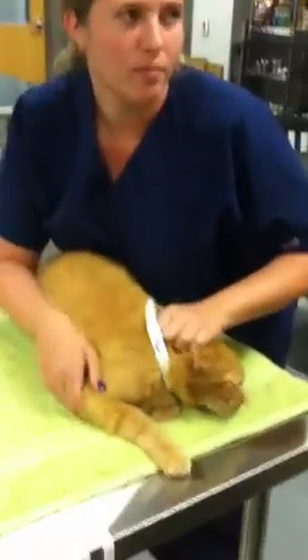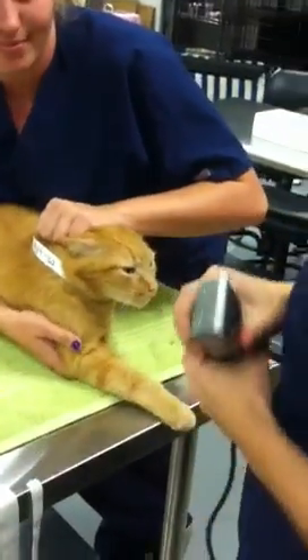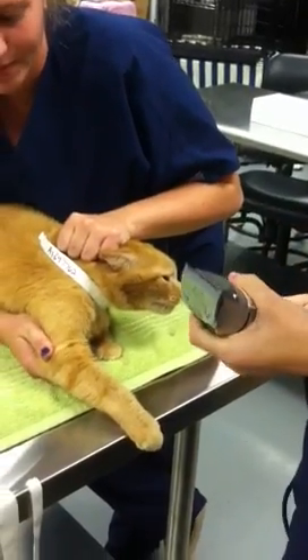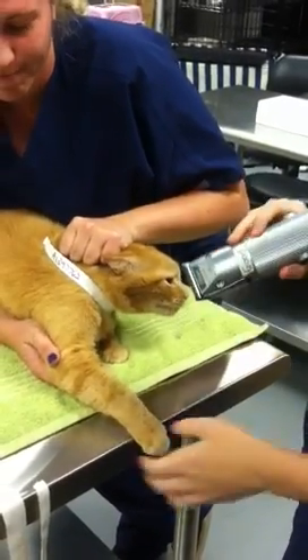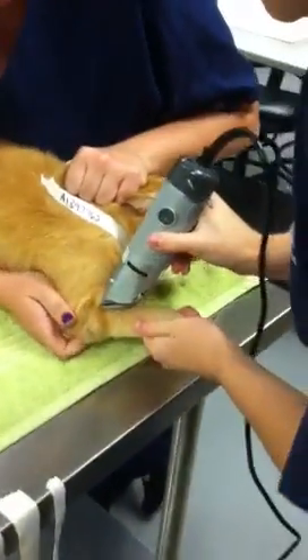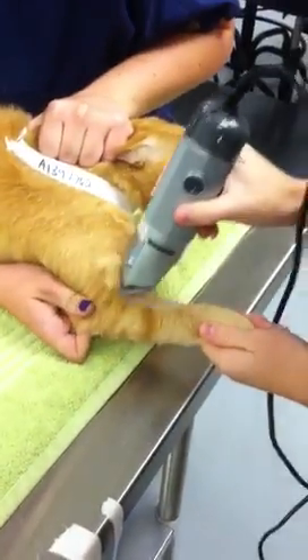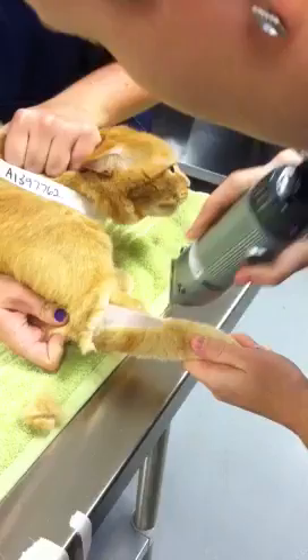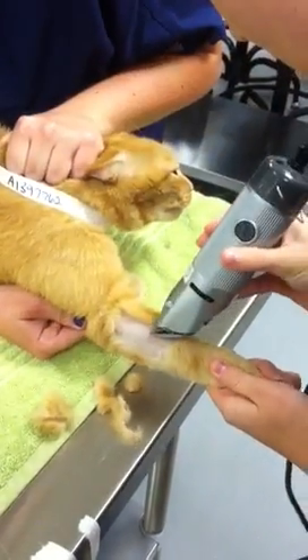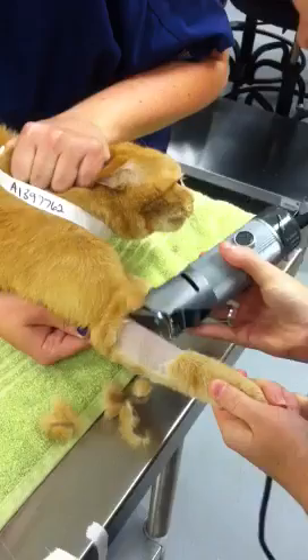We're going to start off the procedure for placing a cephalic catheter by shaving the cat's arm all the way around so that the tape can stick. Heather is holding the elbow out to help prevent the cat from retracting it so that I can have better access.